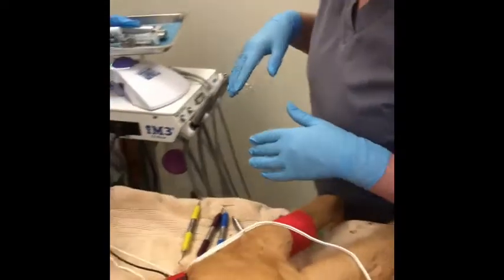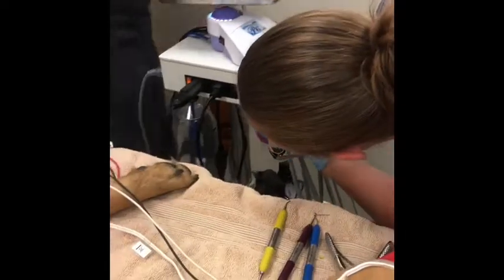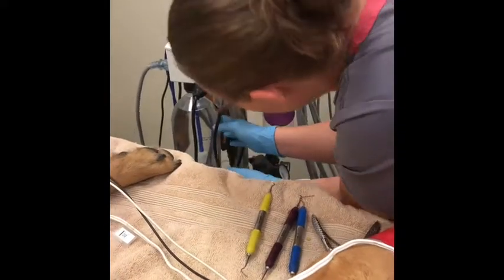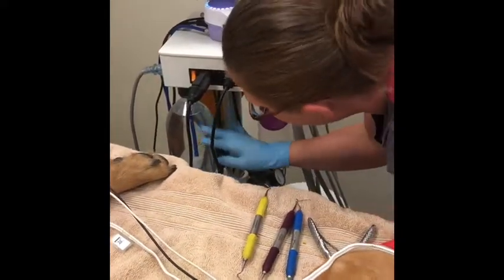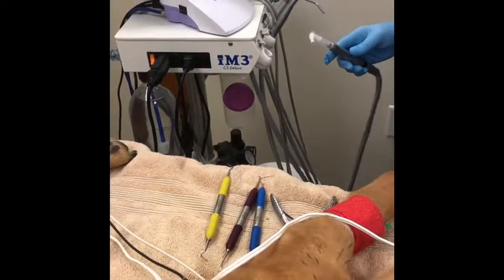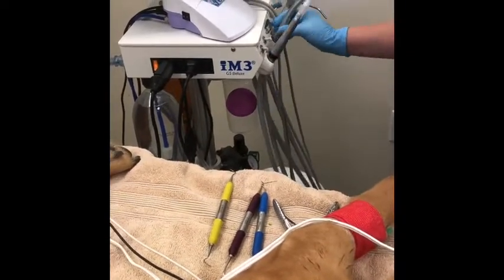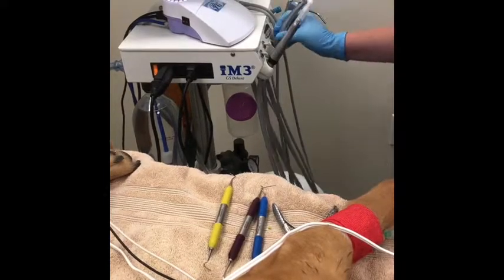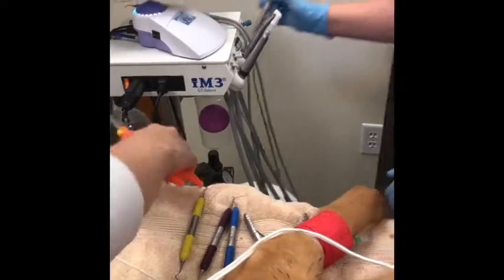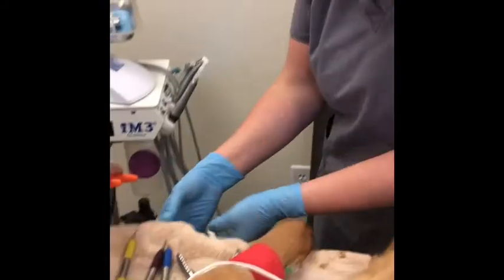Here's our dental machine. We have actually already checked it to make sure it was full of water. We just filled it up and that looks good. It looks like all the parts are actually adequate and it's working well.